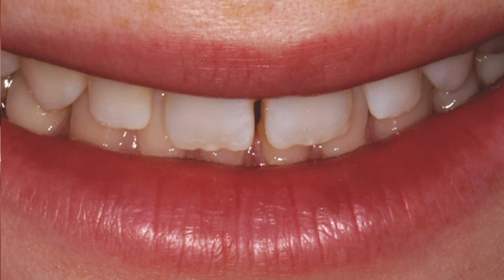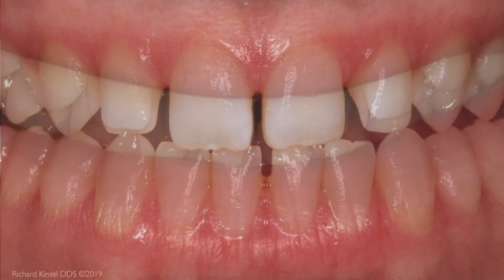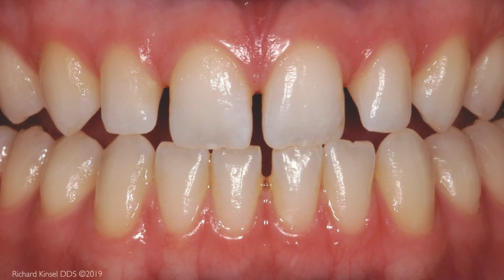This young patient has narrow existing teeth. Her orthodontist moved the teeth into optimal positions so that the porcelain veneers can duplicate proper width and length.